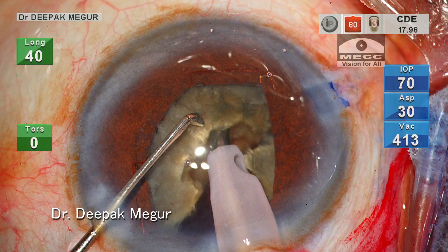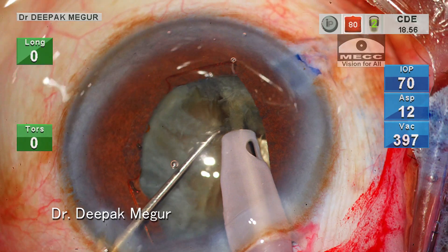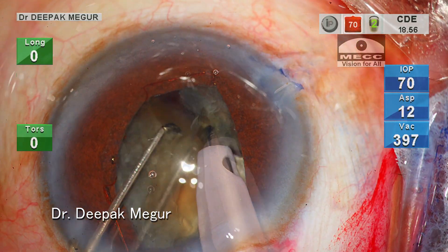Now the second hemi-nucleus needs to be divided. The tip is buried deep up to the sleeve to ensure better grip before performing the vertical chop and then the lateral separation maneuvers.